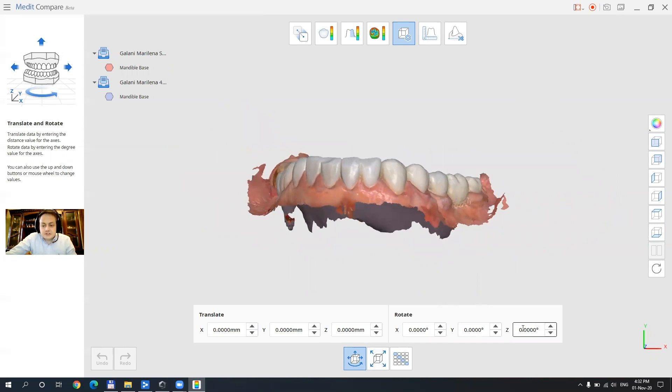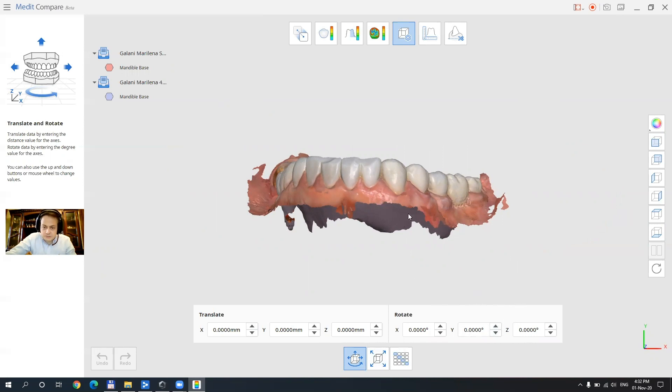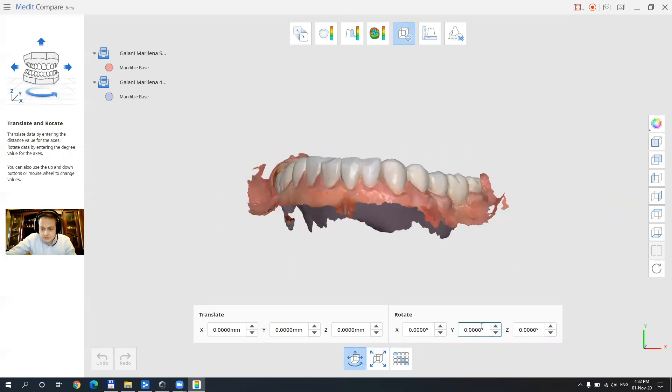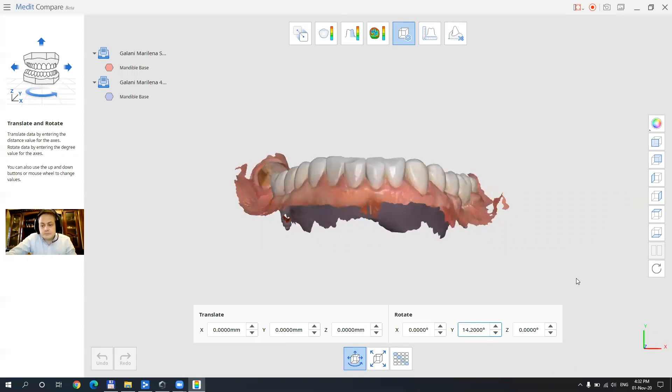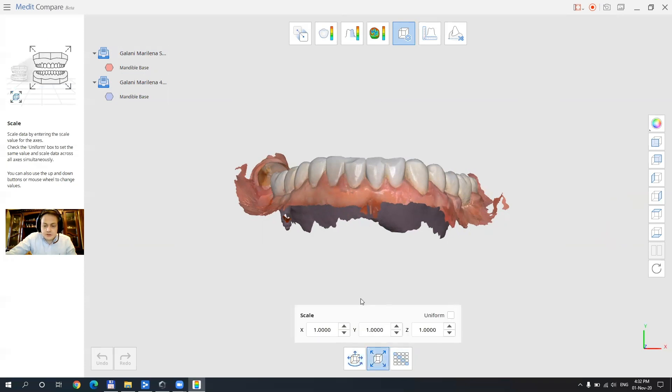So right here I could for example want to turn my model to face me. Let's see how this works for let's say 12 degrees yeah maybe even 40, 14. Okay both models have rotated and we can also scale them on every axis together or just on one axis.